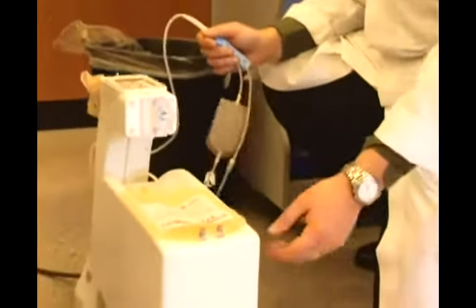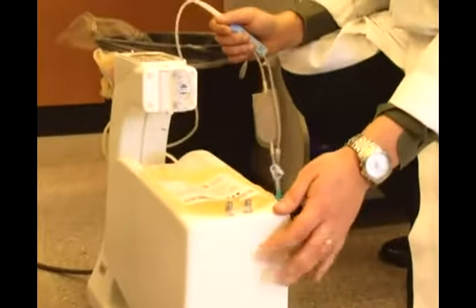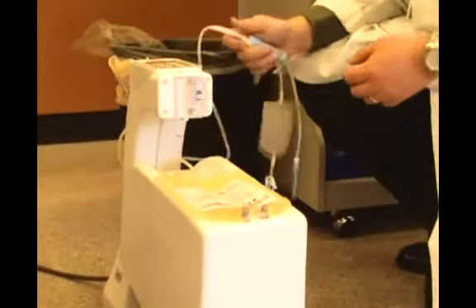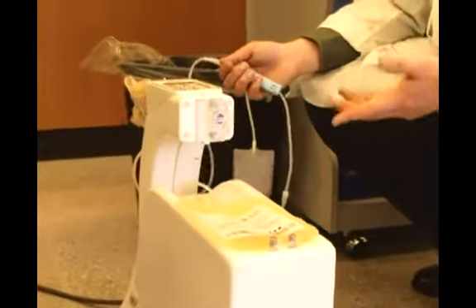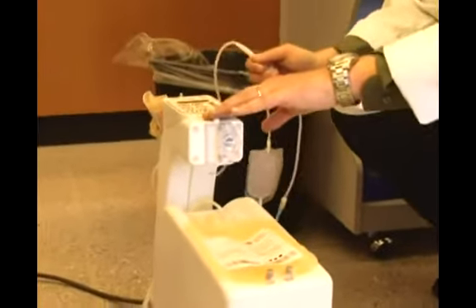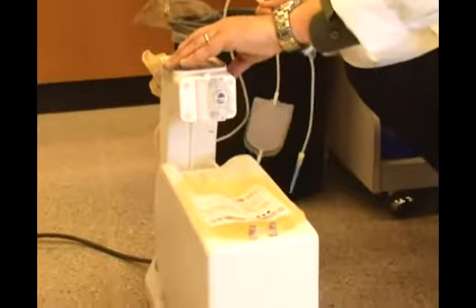So what this scale is going to do, it's going to rock back and forth. There's an anticoagulant in this bag that we want the donor's blood to mix with to make sure that there's no clots. So when we start, it rocks back and forth like this.